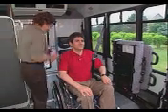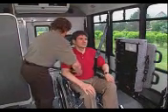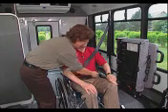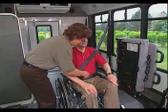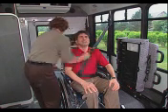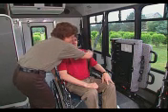Take the snap hook on the shorter buckle strap and thread it down and through the gap between the wheelchair back and seat. Connect it to the D-ring on the rear retractor. Then, snap the buckle connector into the push-button buckle and adjust the webbing using the adjuster to fit low and at the occupant's pelvic zone, near the hip and opposite the side from where the shoulder belt extends. Pull on the belt to ensure that everything is properly attached. To disconnect, press the button on the buckle.